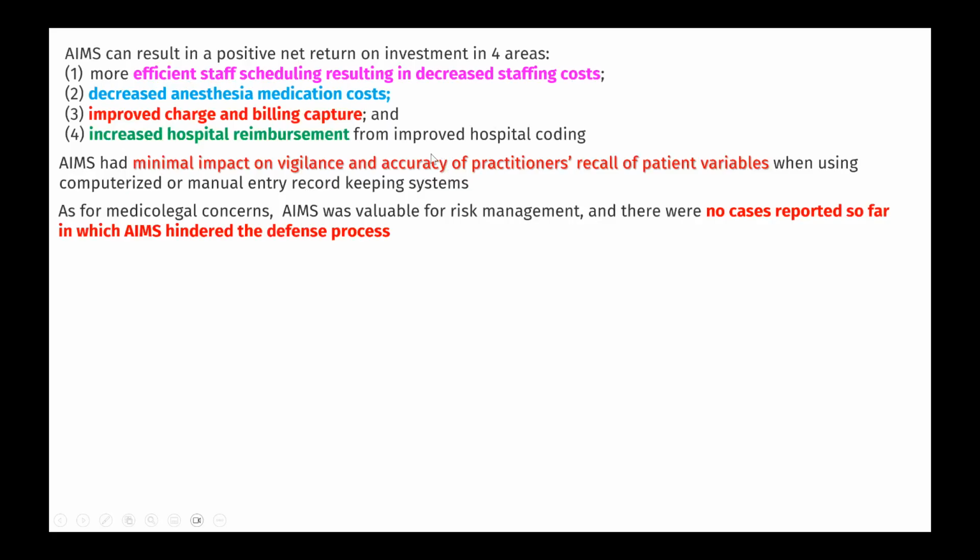So you may not remember what happened. For example, if some calamity happens during the conduct of anesthesia and there is an inquiry after 2 months, you may not remember exactly what happened at that particular time. But if you go through the records, that will immediately show that there was an acute hypotension for so many minutes, and there was some delay in resuscitating the patient after cardiac arrest. All that can be permanently recorded by using this software and hardware system, which you cannot remember in case it has to be recalled, and then some investigation has to be done in such a situation.